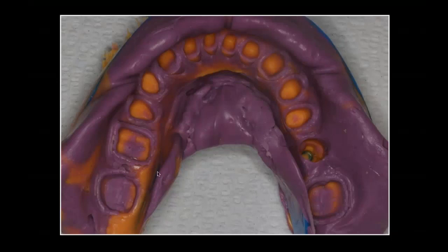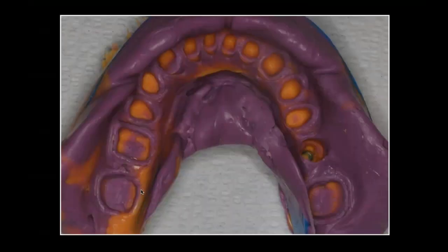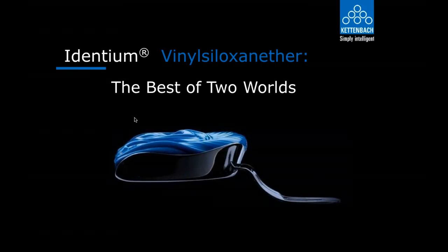One of the things I want to show you is this full arch impression. Down here where you can see the arrow, I have a distortion. I have a tear, and that happens. Do we send it to the lab and tell the technician to go ahead and force that, or fudge that? No, we'll do a pickup. Just a plain quadrant pickup. It only takes about 5 minutes, and my laboratory technician doesn't have to wonder where the margin is. You want to make sure you cover yourself and give them exactly what they need. So we've got good isolation.